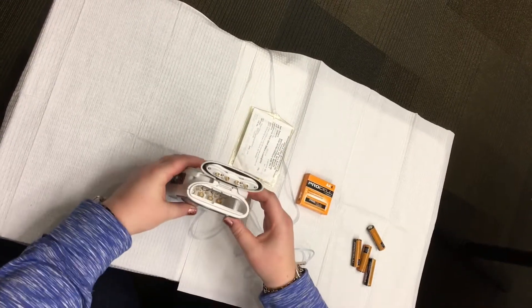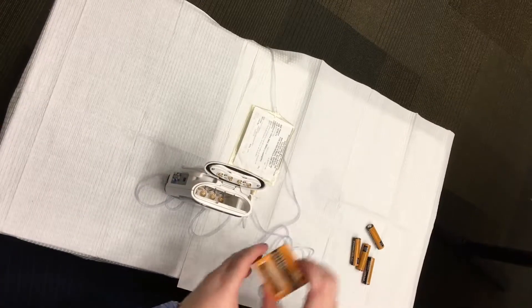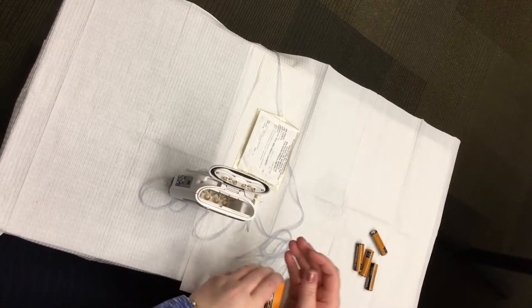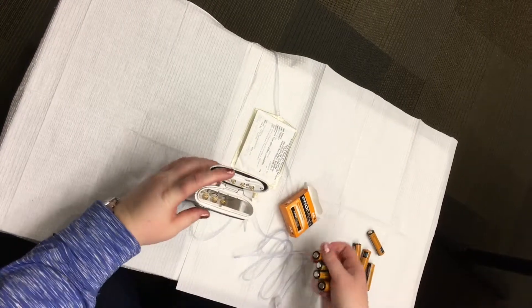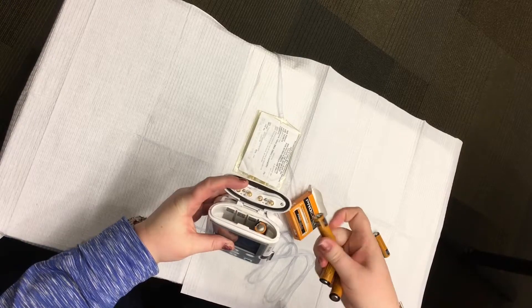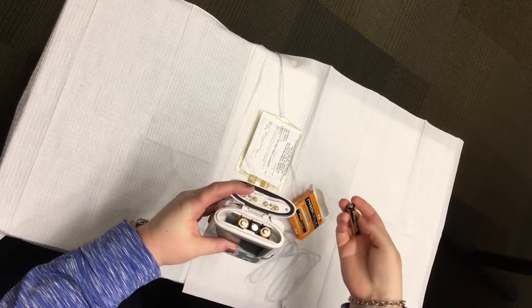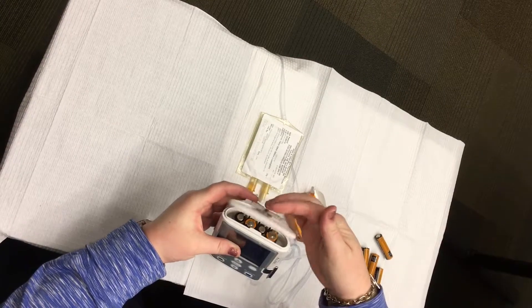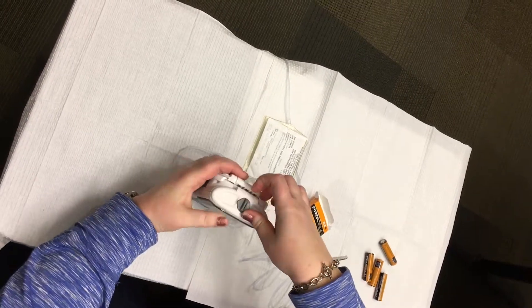Make sure to match the positive and negative markings on the batteries with the positive and negative markings on the pump. Close the door and turn the knob on the battery door clockwise to lock.